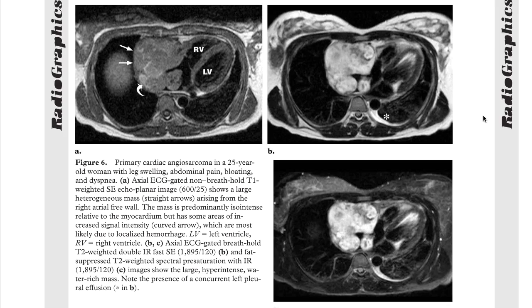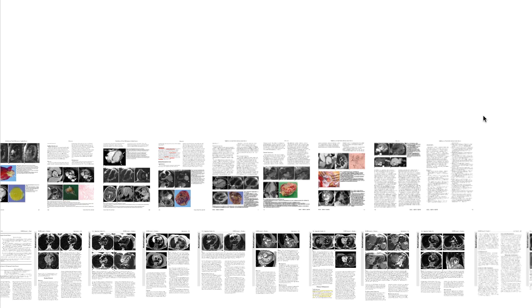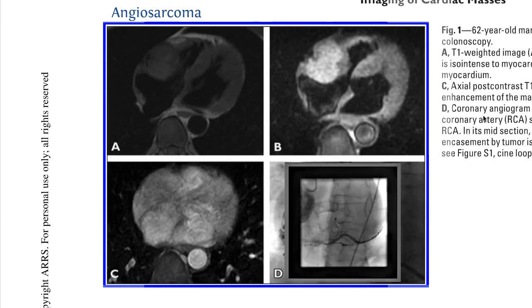So look at the amount of enhancement that we see here. Angiosarcomas light up like a light bulb. It's a very vascular tumor and very aggressive. No saturation with fat sat in that case.